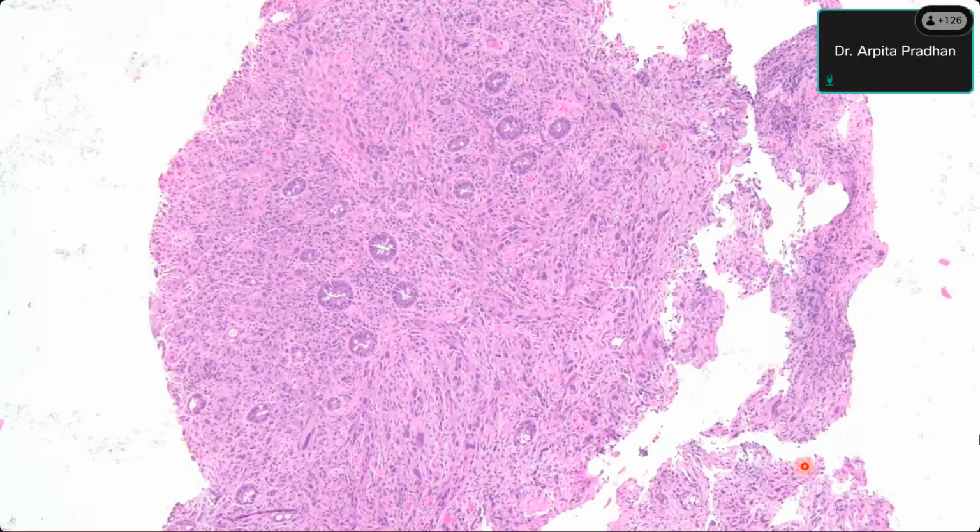Yes, sir. We can see that the cells are arranged in a fascicular-like pattern. Is it rectal mucosa or not? First thing, once you see the biopsy, say a rectal biopsy, you should see whether there is any rectal mucosa or not, because this is an endoscopic or colonoscopic biopsy, so they are going to punch it out. At least mucosa should be there. Can you see anything normal here? What is normal, what is abnormal, and what is their relation? Can you describe that?